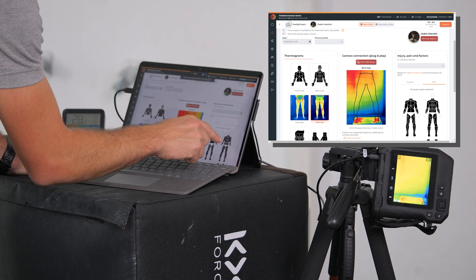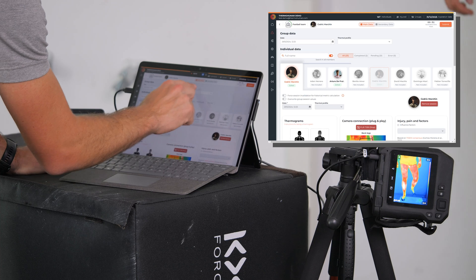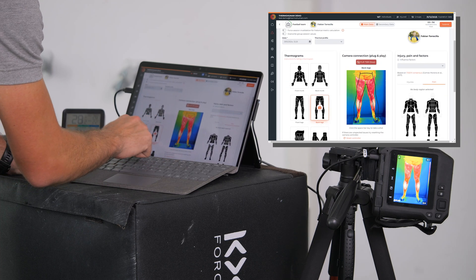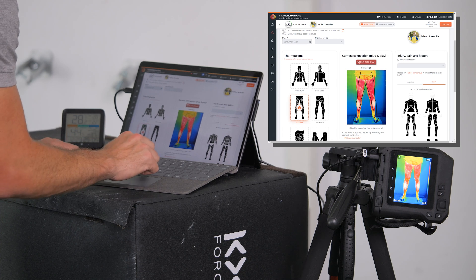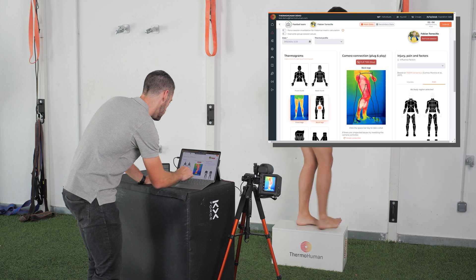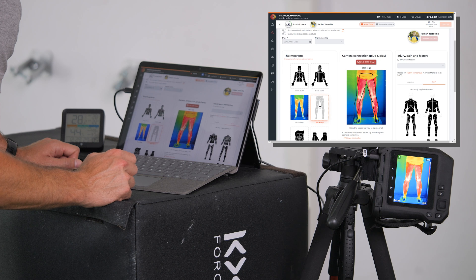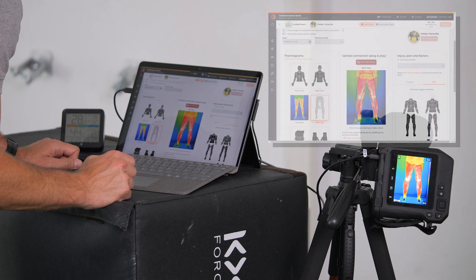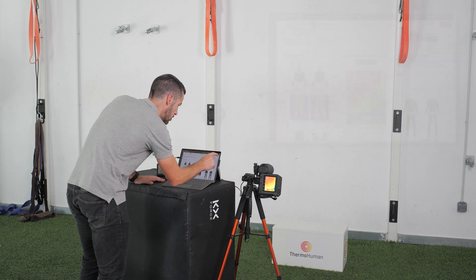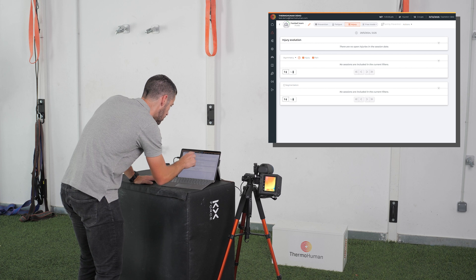Remember that we can select any pain or injuries at any time by selecting the body area, and it is very important to also select the thermal profile for that moment. For the third player, we go to the correct protocol, press the space bar, ask them to turn around, select the other protocol, and press again. Once we have finished with all players, we click on submit and will see the results for those three players.